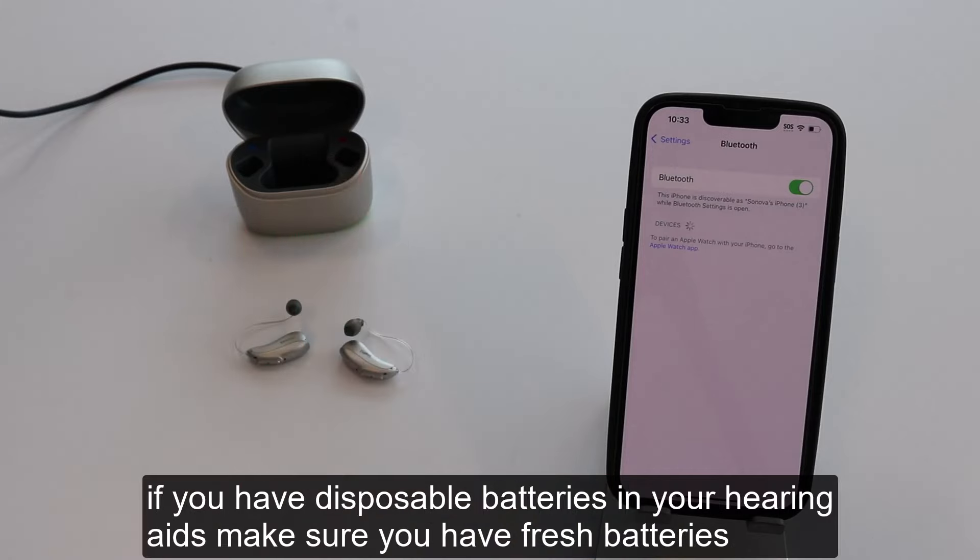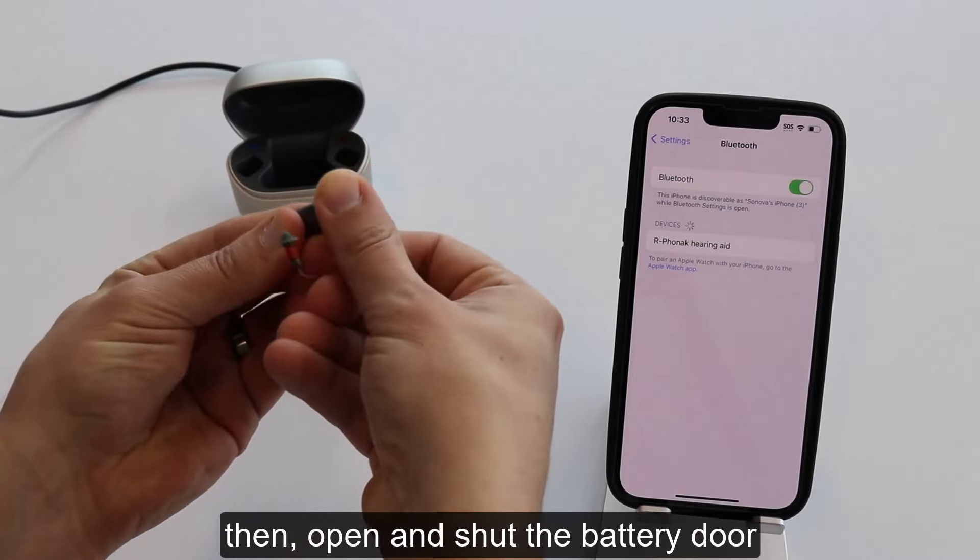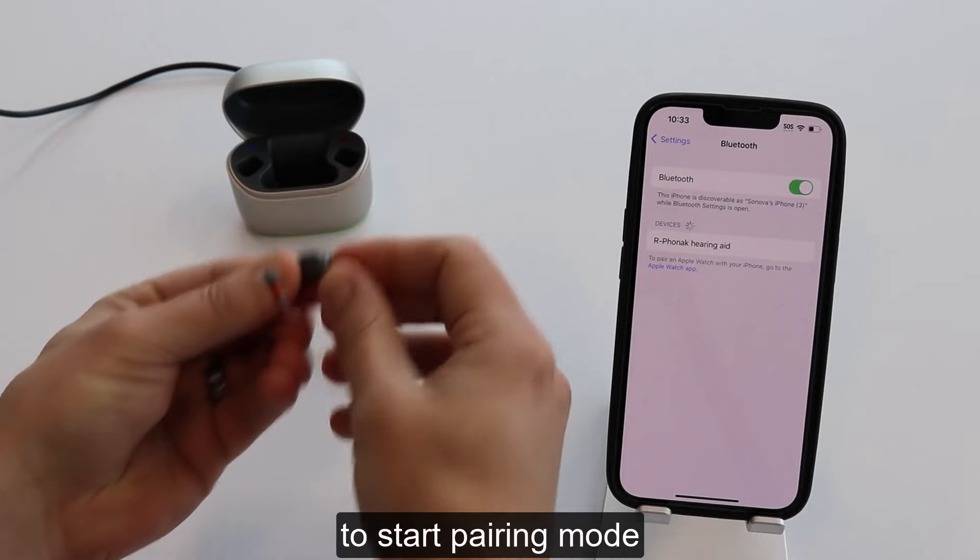If you have disposable batteries in your hearing aids, make sure you have fresh batteries. Then open and shut the battery door to start pairing mode.